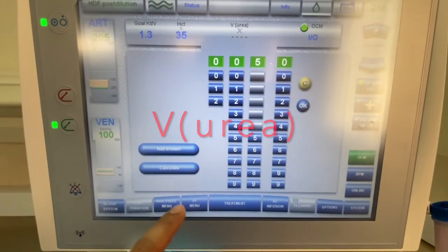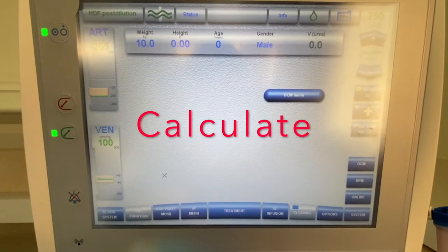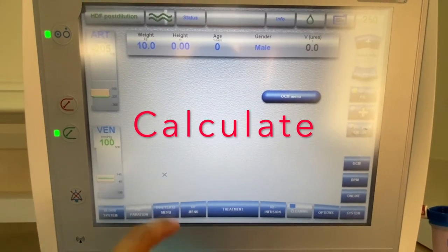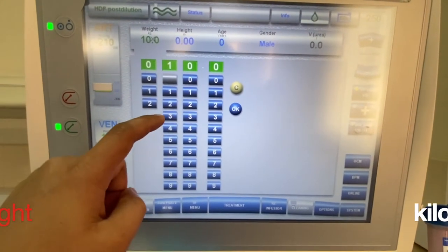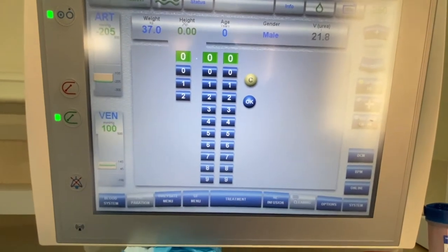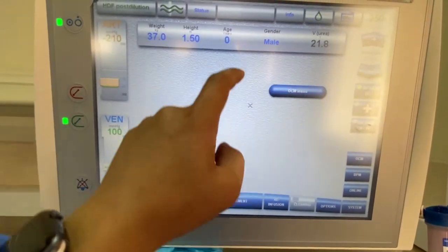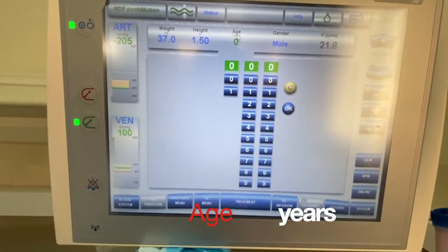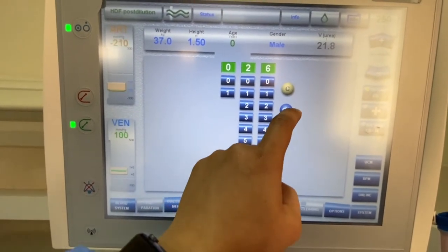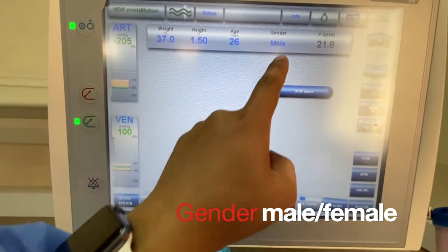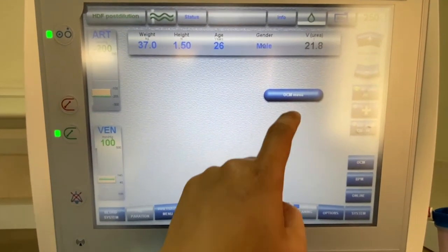Press on the value and calculate. To calculate, we input the values: weight in kilograms, height in meters, age, and lastly the gender of the patient. Then you go back to the OCM menu.